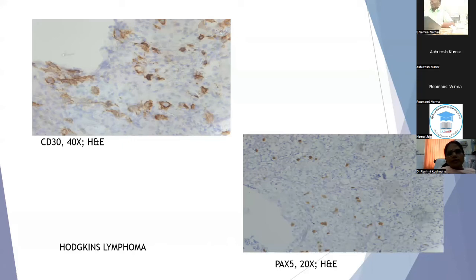So if there is pancytopenia in the peripheral smear and the aspirate is diluted, we must proceed with the Trephine section. Look for the presence of the cells in the Trephine section. Look at the morphology of the cells. Look at whether all the lineage cells are present properly, or if they are reduced. If there are abnormal cells present, we have to try to correlate it with the history of the patient and the clinical findings, and this correlation will help to a larger extent to reach a diagnosis.